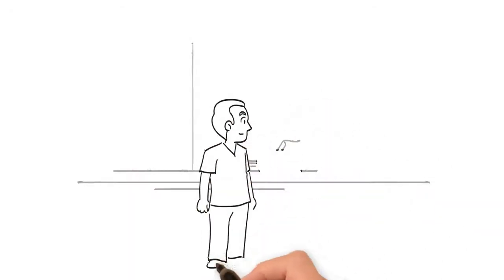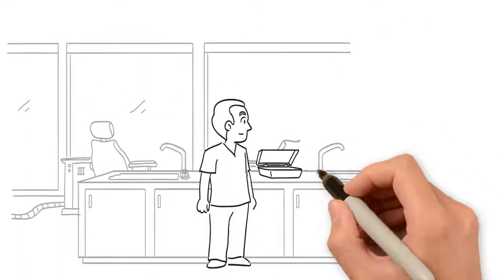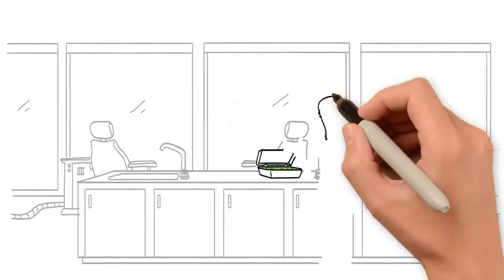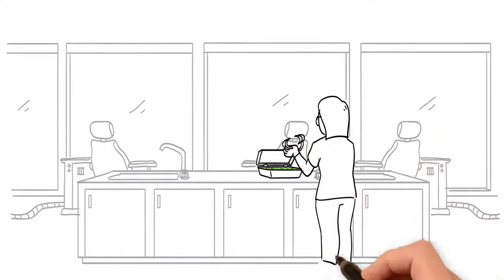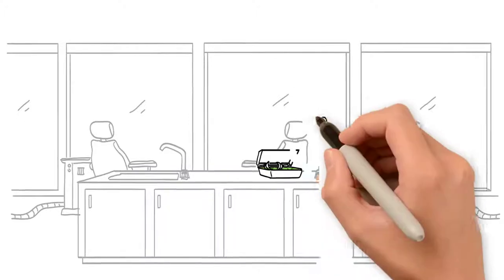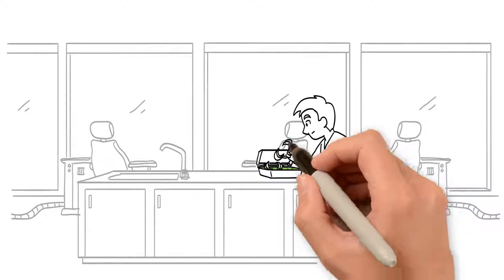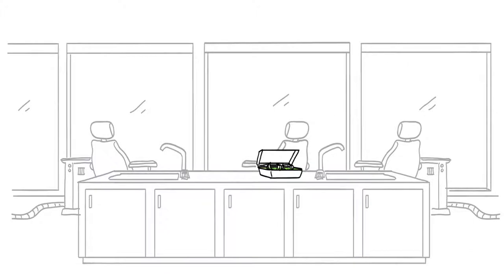A typical scenario in an orthodontist office is that they utilize the same cold, sterile liquid to clean their equipment, which they shouldn't be using. Chemical immersion sterilization is no longer considered appropriate for reprocessing heat-stable medical instruments. Studies have proven that a sterilization process using liquid chemicals cannot be verified by biological spore test monitors. These days, the CDC refers to heat sterilization as the method of choice when sterilizing instruments and devices.